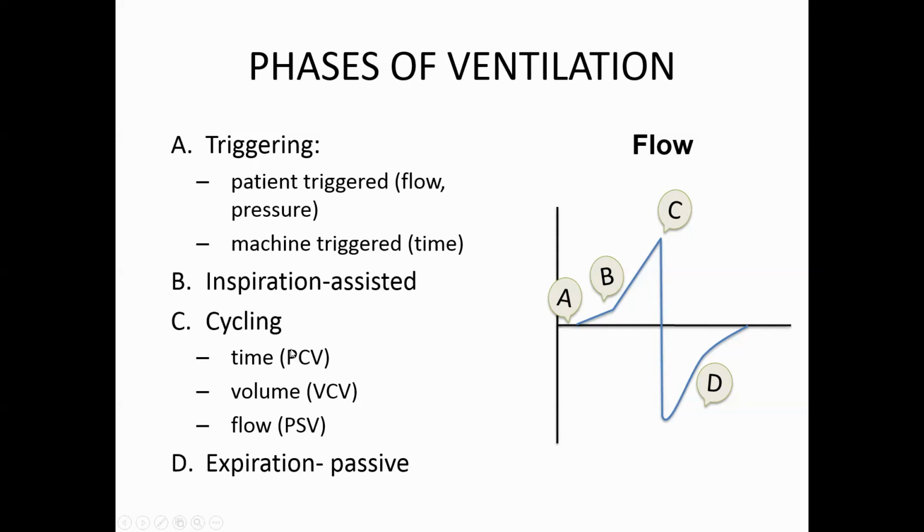It depends on how you decide it. The majority of the modern ventilators at this point in time adjust flow by adjusting time. You remember that the flow is nothing but volume divided by time, right? So if you decide on a pressure control, you decide on a certain time frame to give the breath through, and by doing so, the flow will be determined, and depending on the compliance of the system, the volume will be dependent on that.